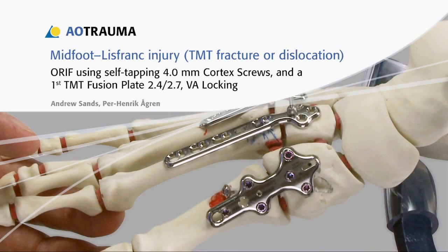In this presentation, the treatment of a Lisfranc injury will be demonstrated using open reduction and internal fixation, ORIF, with 4.0 mm self-tapping cortex screws and a first TMT fusion plate 2.4-2.7 VA locking.